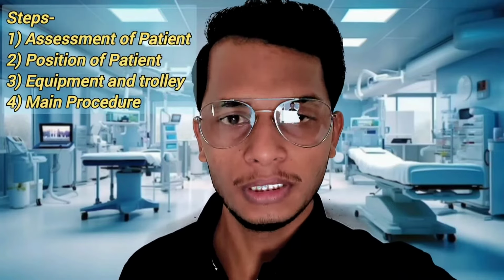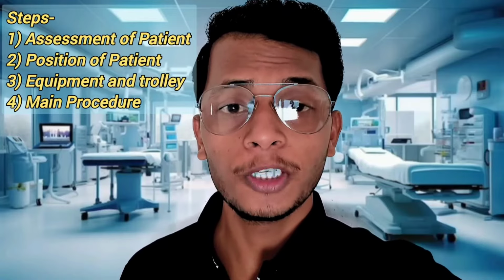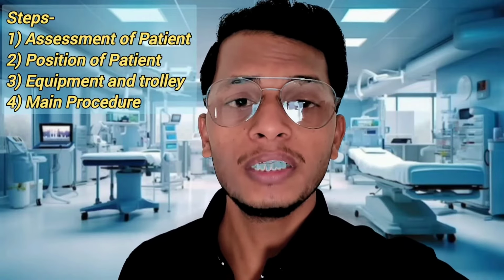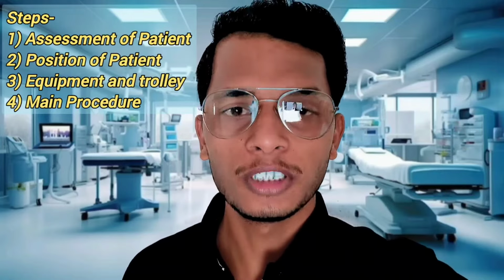This is how you can develop your skill for central line placement in only 4 steps simply. First one is the assessment of the patient, second one is giving an appropriate position to the patient, third one is the equipment and the trolley that you require during the procedure, and the last fourth one is the main procedure.